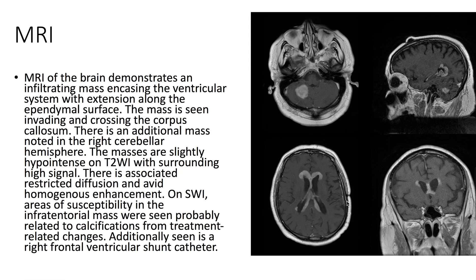On MRI, we see infiltrating masses encasing the ventricular system with extension along the ependymal surface. The mass is seen invading and crossing the corpus callosum. There's an additional mass noted in the right cerebellar hemisphere.